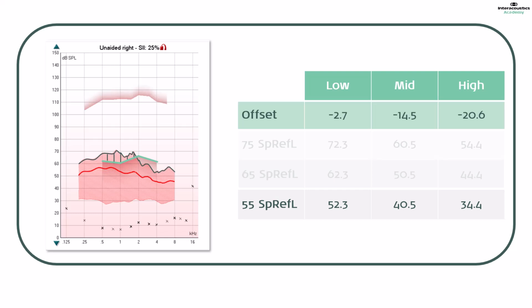If the patient's hearing loss is incredibly mild, then the 55 dB stimuli may be audible unaided. It is important to question whether the aided results are going to provide useful clinical information if benefit cannot be demonstrated. If the hearing loss is closer to the moderate end of the mild range, then the 55 dB stimuli may be inaudible when unaided.